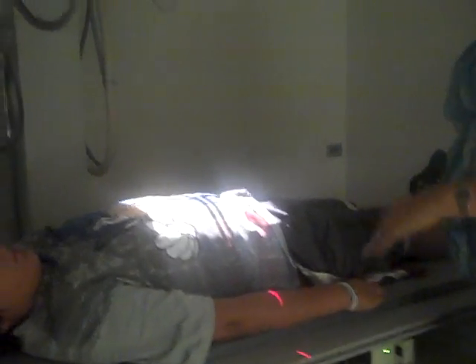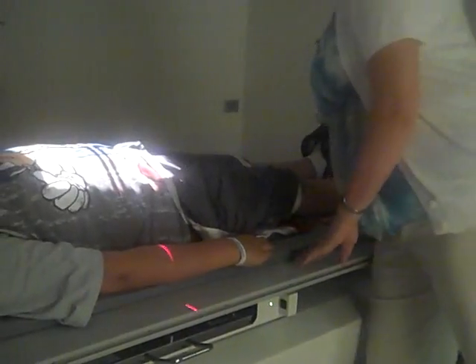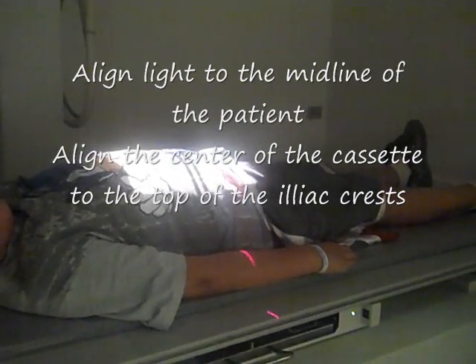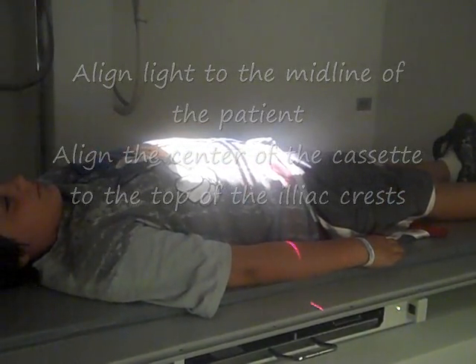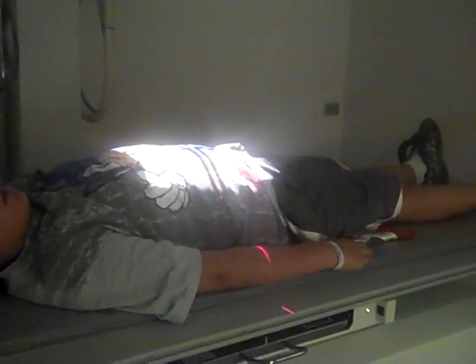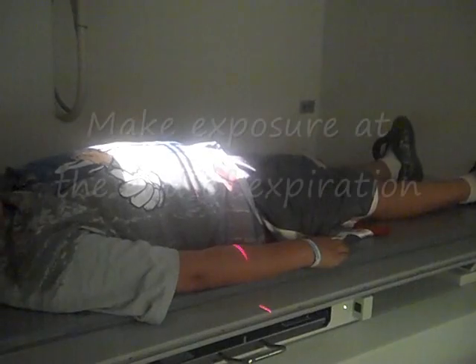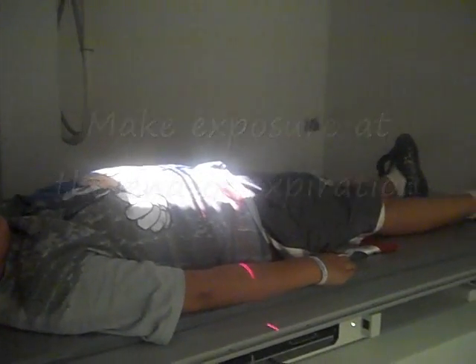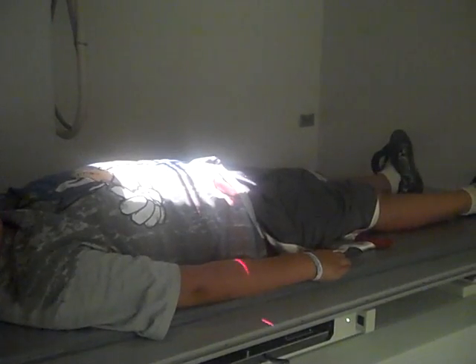We're using a 40 inch SID for this. Then step out of the room. Have your patient blow their breath all the way out. Hold your breath out. Hold very still.